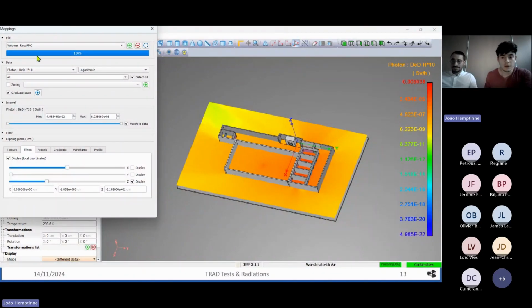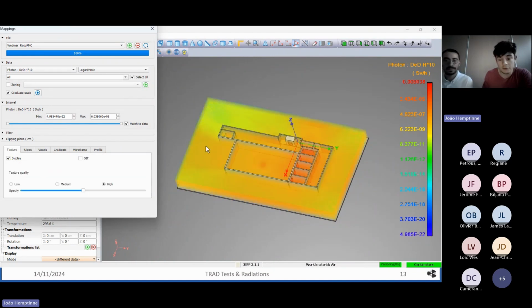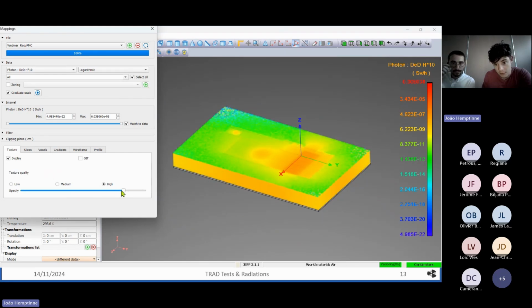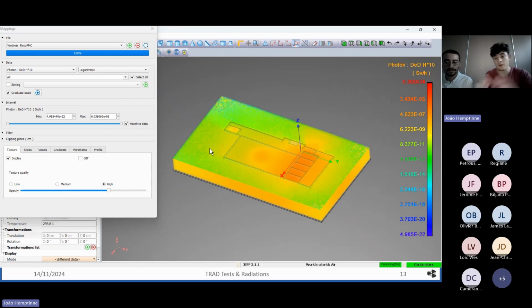Okay, thank you, Joao. As Joao just said, you have different ways to visualize your 3D mapping. The first is a texture mode, where you can set the opacity of the texture right there, in order to have a general view of your 3D mapping.